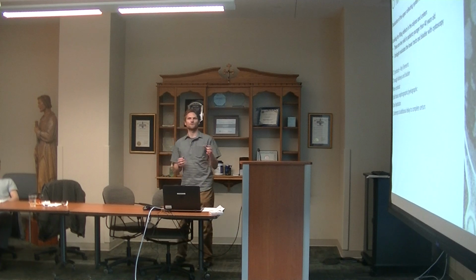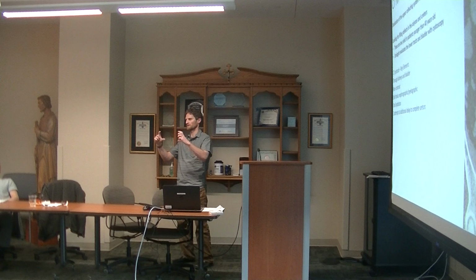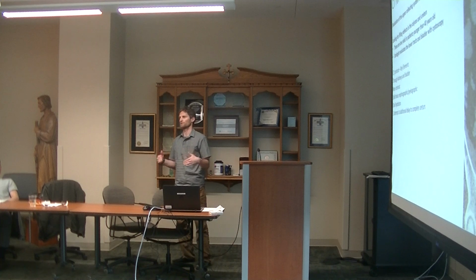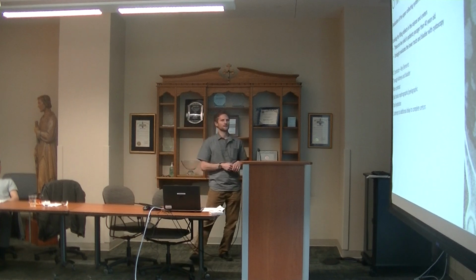And I would say if you don't, sometimes we do repeat delayed sequences. If you don't see sections of the ureter, I would say do that once. You don't need to do it any more than that. The likelihood of significant pathology in the ureter that otherwise looks normal is so low that it's not worth the benefit of all the extra radiation. So those are the CT IVPs.